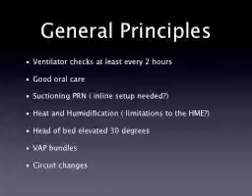This is a VAP bundle, and if you're not familiar with the term bundle, you certainly will be here fairly soon. Basically, this is a bundle of interventions that are required on every ventilated patient. A lot of hospitals have gone to these bundles to try to prevent pneumonias, and of course these bundles include interventions like elevating the head of bed, good oral care, so on and so forth. High-low endotracheal tubes that can suction around the cuff and things of that nature. A VAP bundle is a ventilator-associated pneumonia bundle, not uncommon to see on ventilated patients.